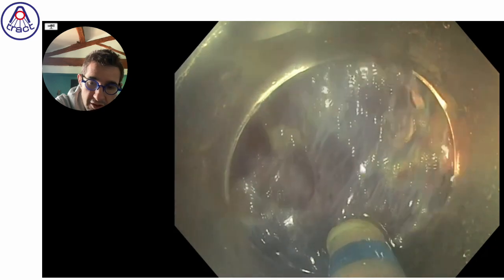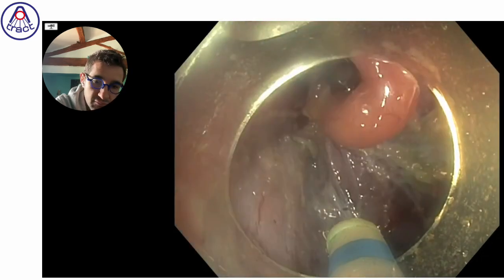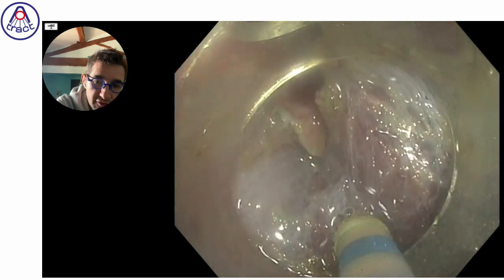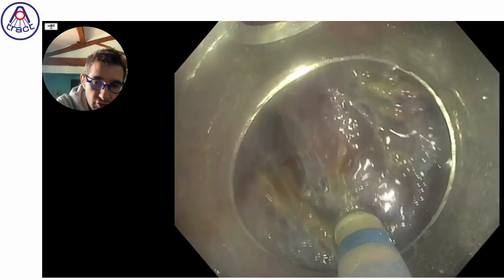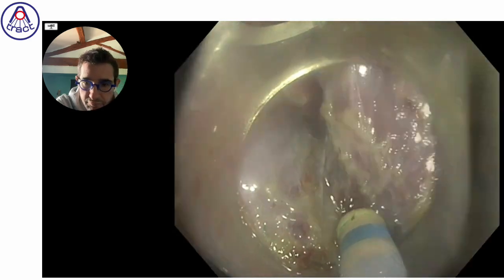I think we tighten in mostly 80% of the cases, but there are some cases where the exposure is good enough and we don't spend time to tighten the device since we will manage to achieve the resection without any new tightening.